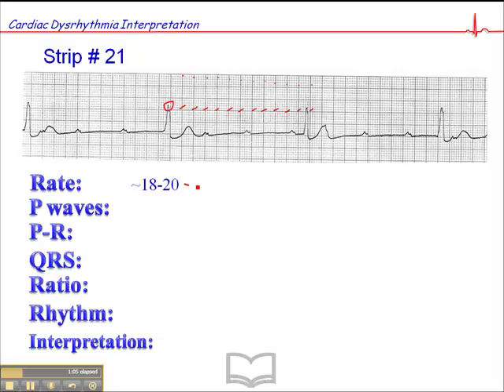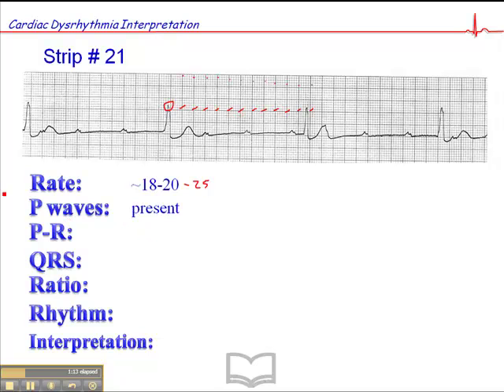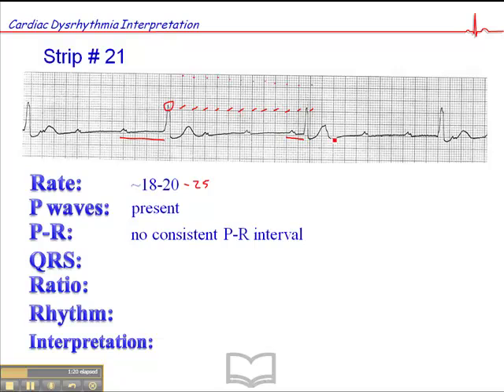You could say around 25 — somewhere in there. It's pretty low, very low. P-waves are definitely present, but there doesn't appear to be any consistent PR interval. This PR is definitely not the same as that one, and that's a bit of a concern. It begs the question: are the P-waves even connected to the QRS complexes? That's the big question.